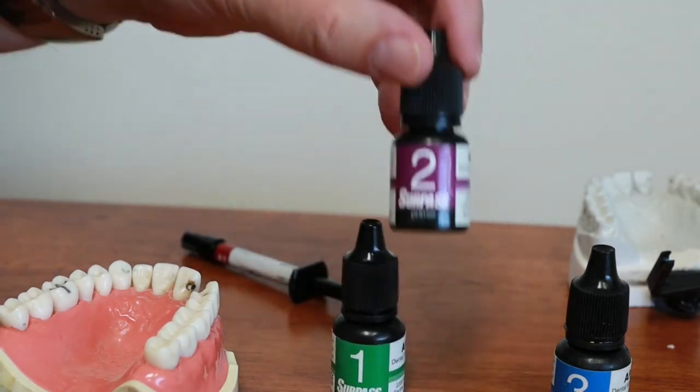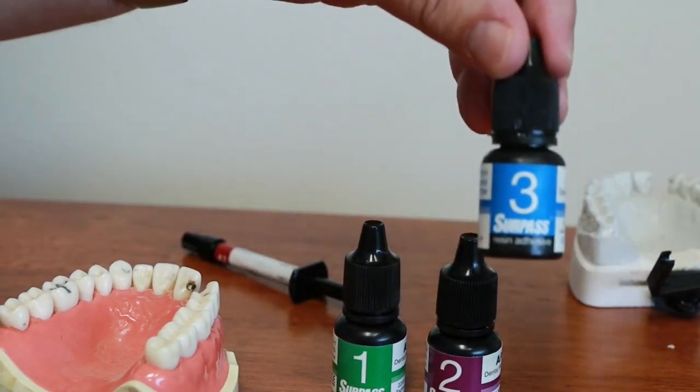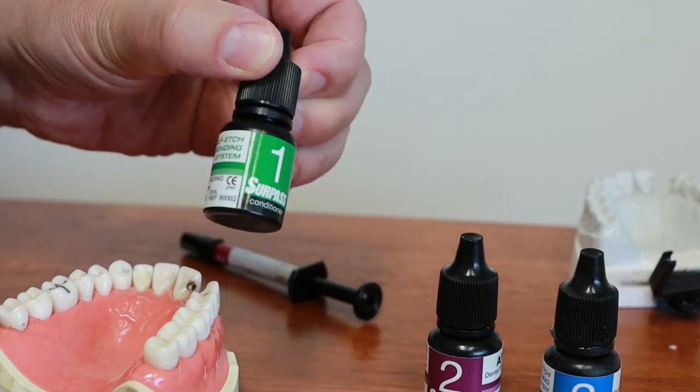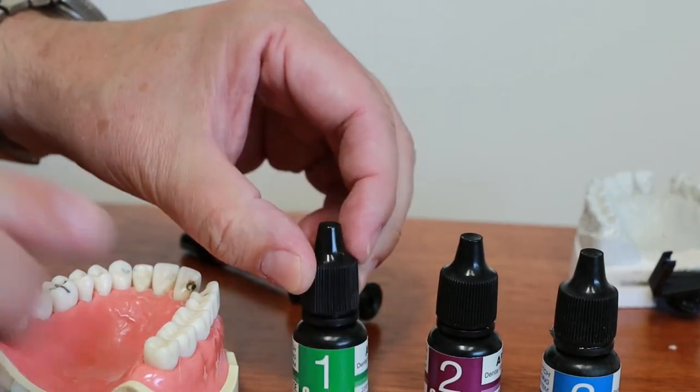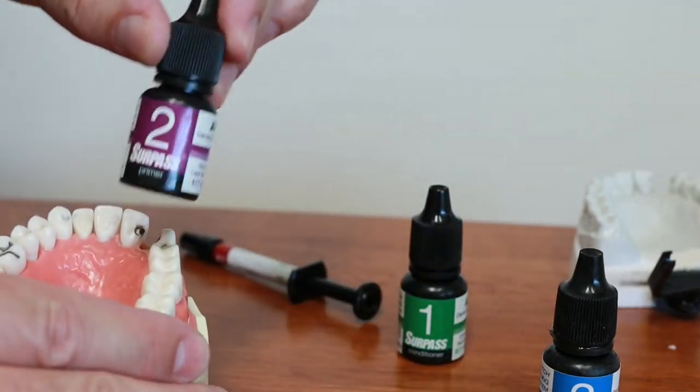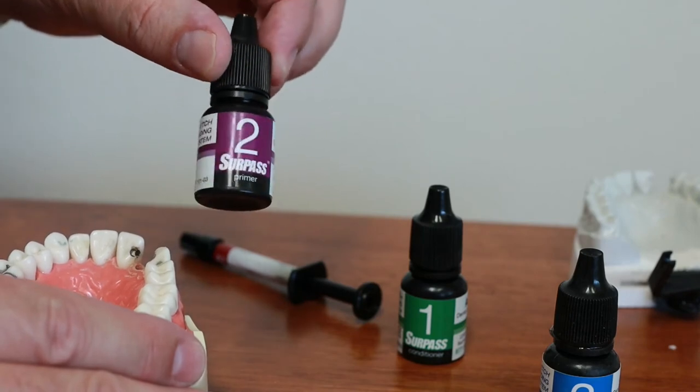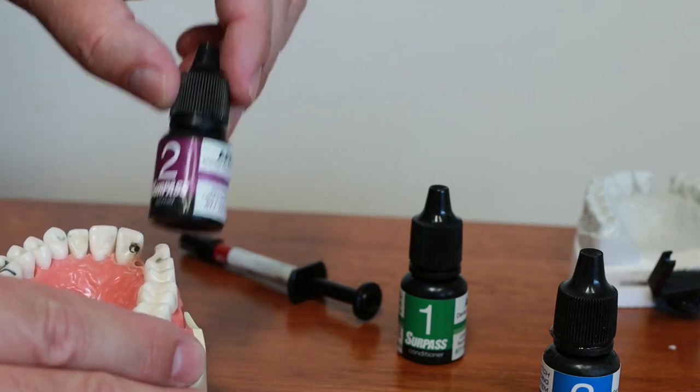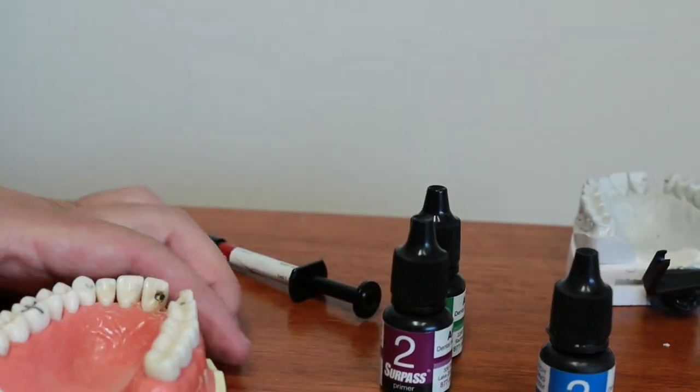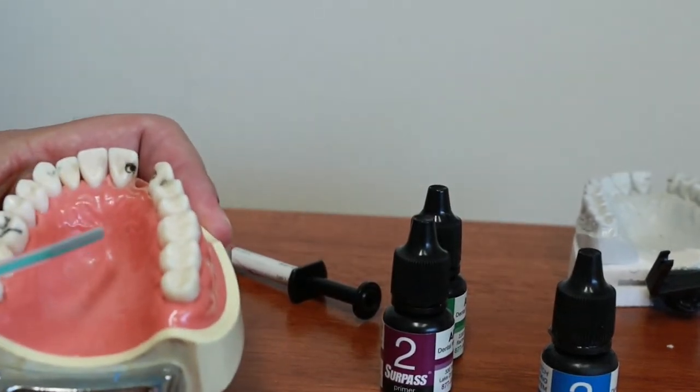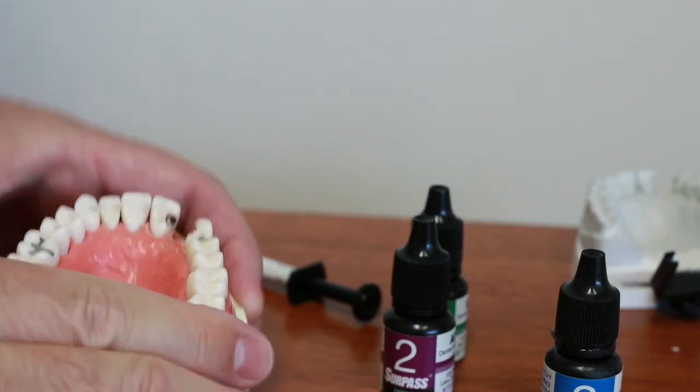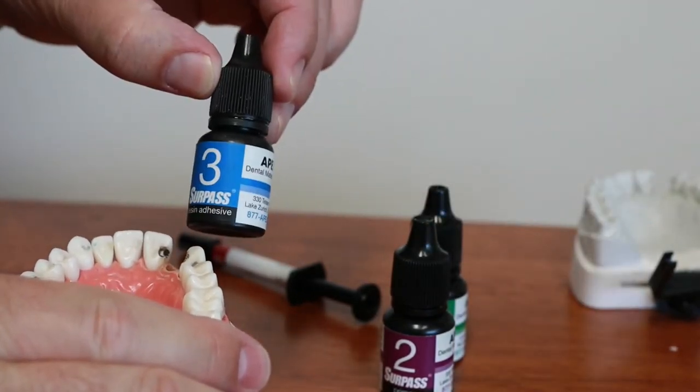First step is bottle number one which is basically the etching. Paint that on for about ten seconds onto each tooth. Then onto each tooth add two coats of number two which is the primer. It neutralizes the etching. Once that's on there then I just air dry it with my syringe. Dry it out really well. And then the last step I use is the bonding agent. This is the actual glue if you will. Put a coat of that on there and then I'll thin it a little bit.